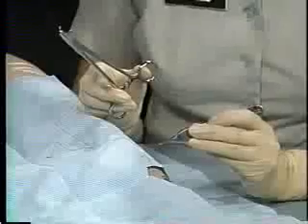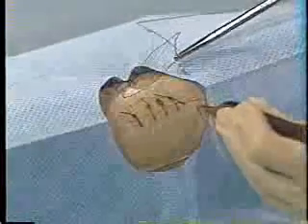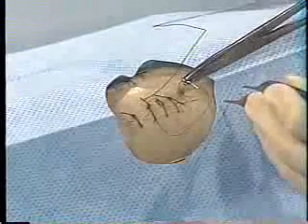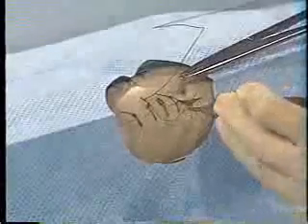It is more comfortable to sew toward yourself. That is, start at the far end of the incision and work back towards yourself. Now hold the needle holder with the tip of the needle and the palm facing down. Pretend that the needle is straight rather than curved and push straight down into the tissue to the desired depth. Then slightly turn the wrist as though you were turning a doorknob.